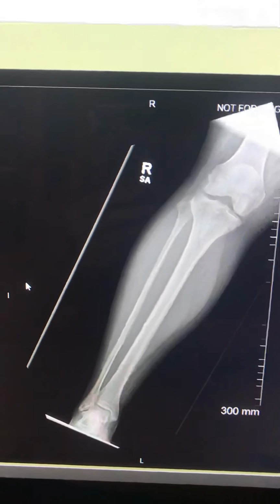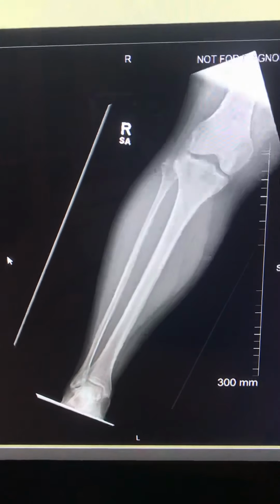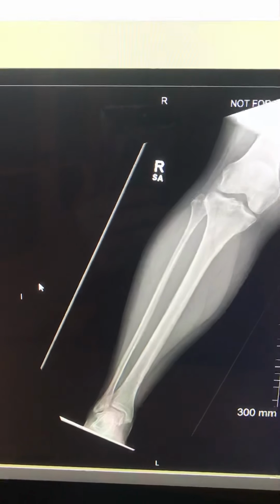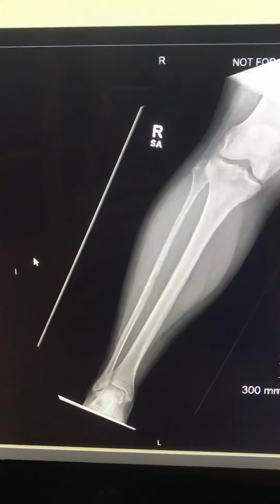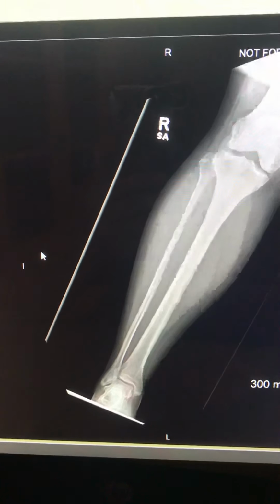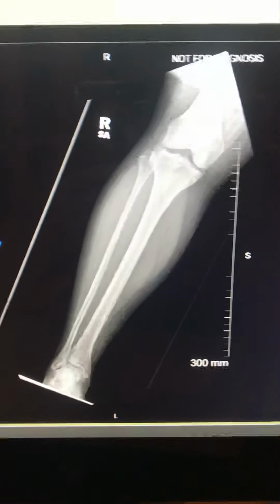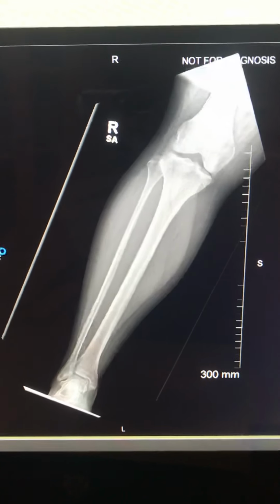The image receptor was a digital image receptor, a 16x16, no grid. Technique was a 44-inch SID. AEC was used. The final technique was 65 at 4 mAs.